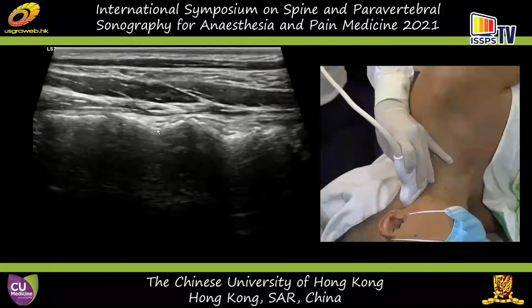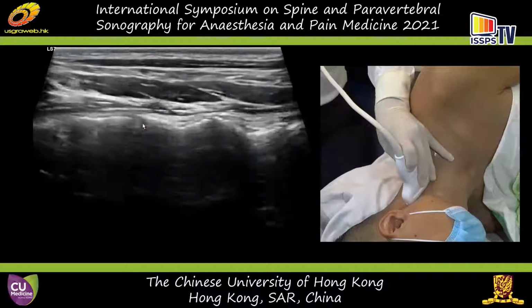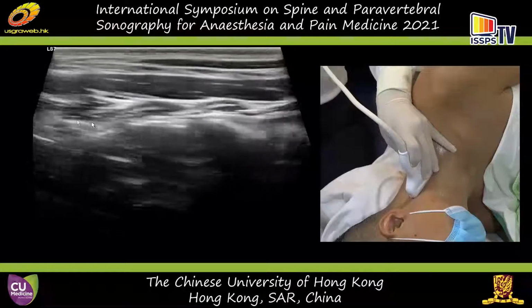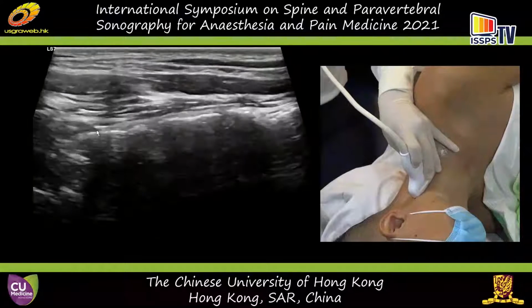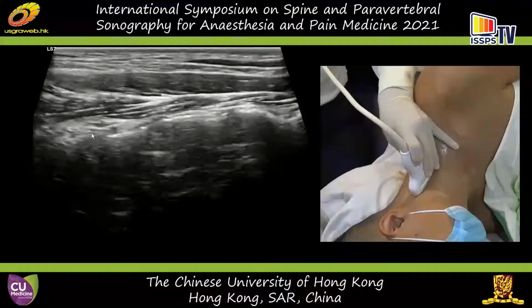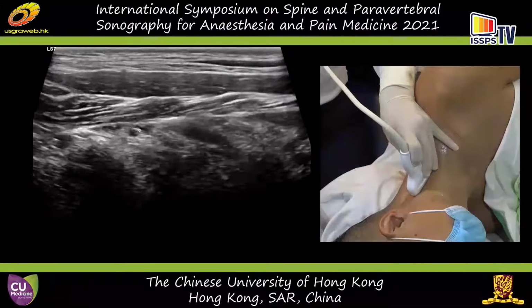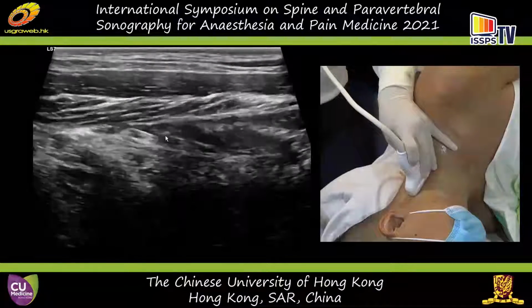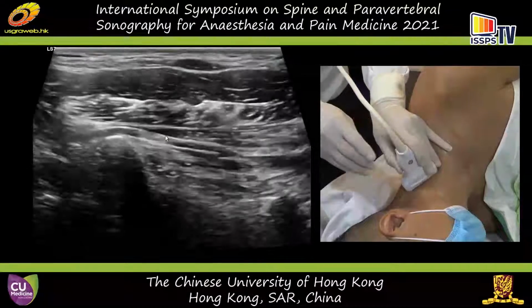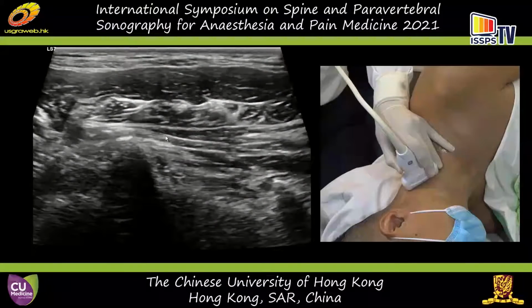And inside the valley here, you can also see the medial branch, and this is C4-5 and C5-6, and this C6-7. And at this point, you can also see another artery which is going posteriorly right here. If I turn this into long axis here, then you can see that's the deep cervical artery.